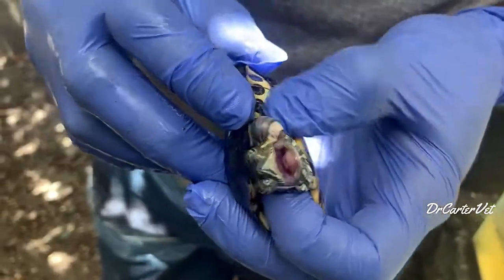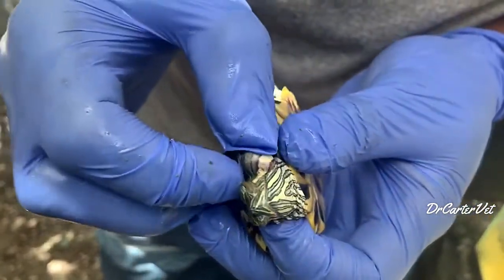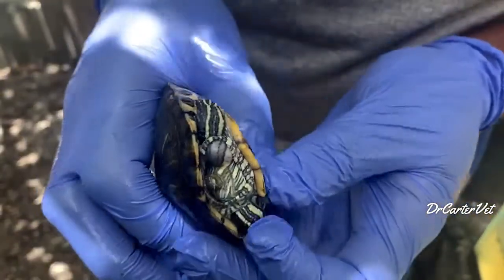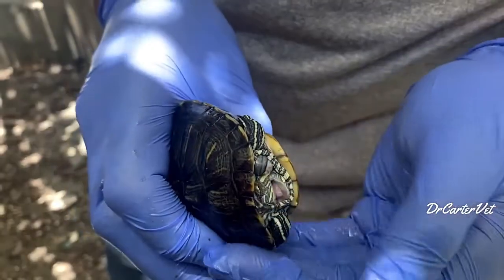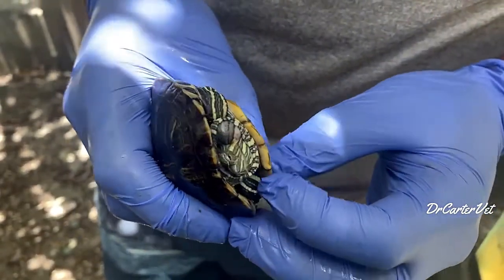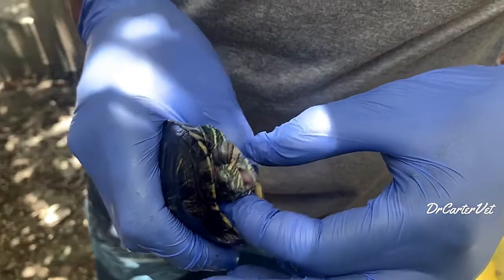This red-eared slider had a middle ear infection, which caused a large aural abscess to form on its left side. It's that big protrusion coming out of its head.